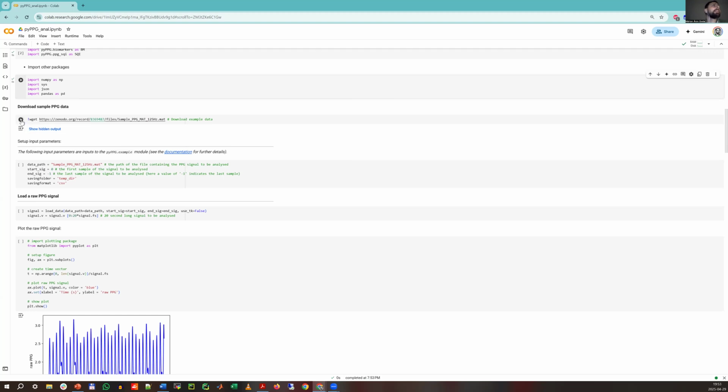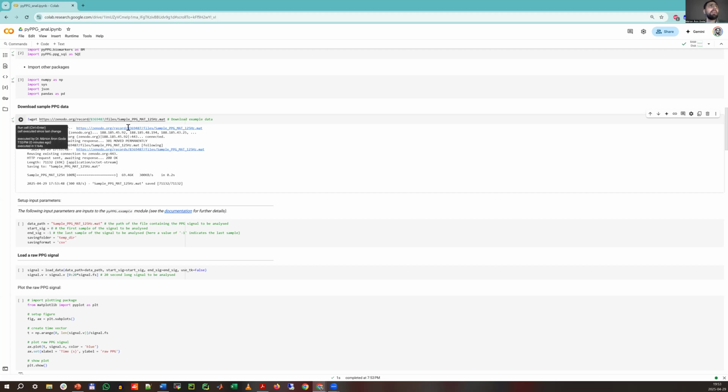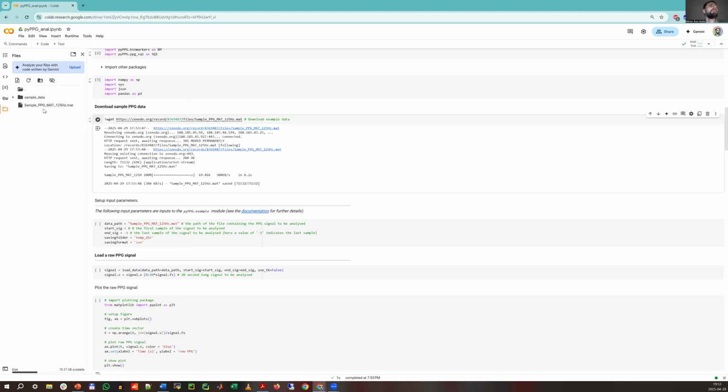And here in the next part, we download the PPG data itself. I already uploaded it to Zenodo. So if you click here, you see that we downloaded the data. So you don't have to care about how you save it.